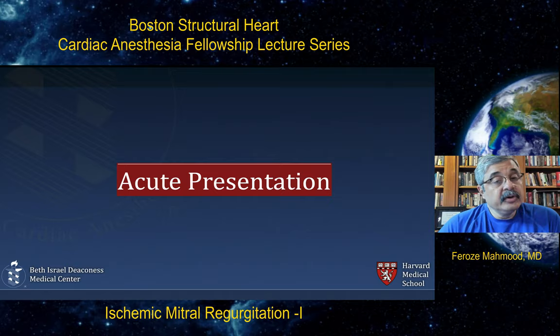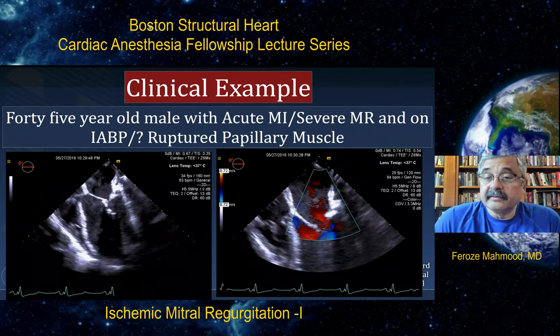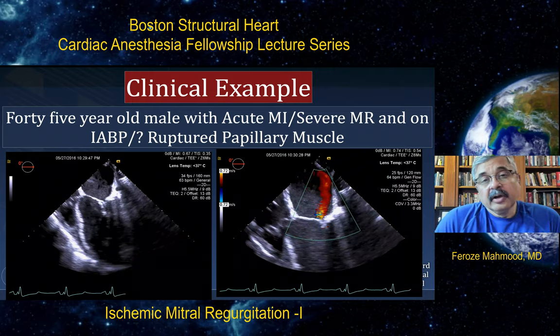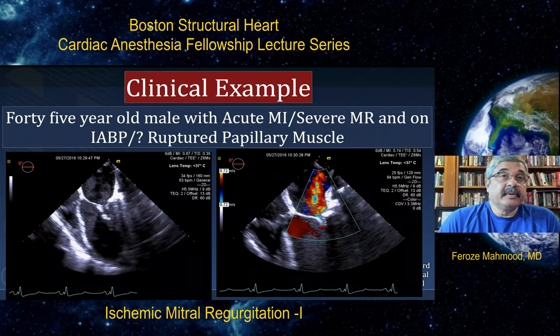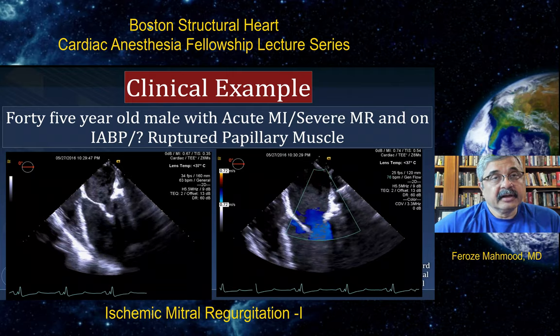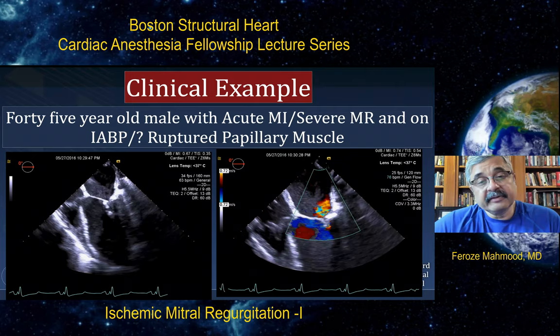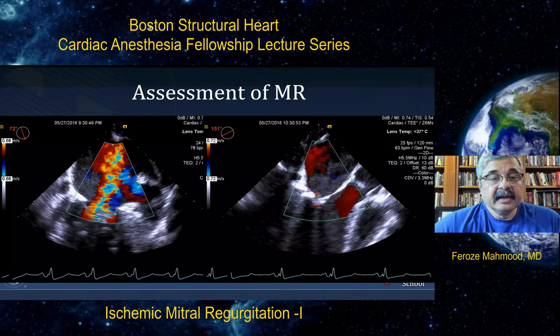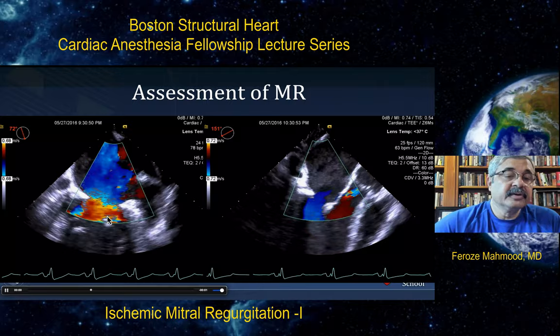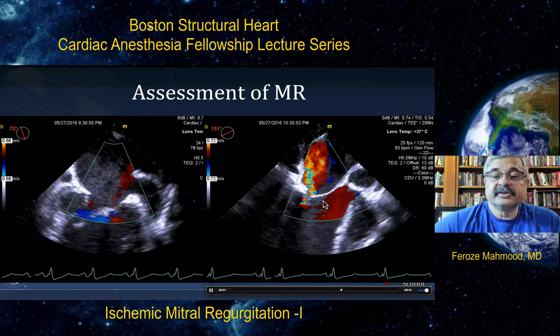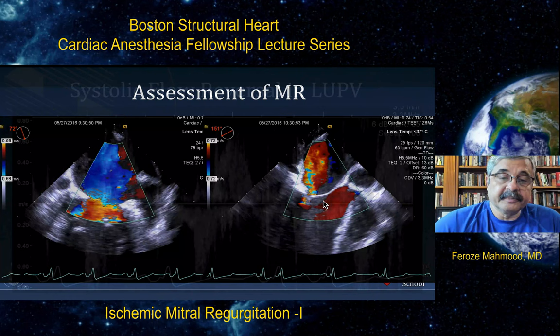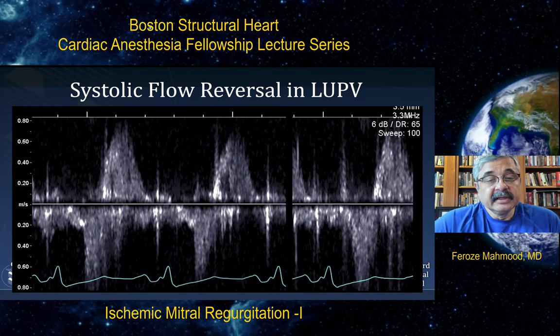Now let's go over an acute presentation. This is a 45-year-old male with acute myocardial infarction, reported to have severe mitral regurgitation. The patient was placed on an intra-aortic balloon pump for hemodynamic support, and there was some suspicion of papillary muscle rupture given the ferocity with which the MR presented. As you can see, it is not necessarily a papillary muscle rupture, but significant tethering of both anterior and posterior leaflets with severely depressed systolic function, leading to significant central mitral regurgitation. Interrogation of the pulmonary venous inflow demonstrates significant flow reversal in the left upper pulmonary vein, implying this is severe mitral regurgitation.